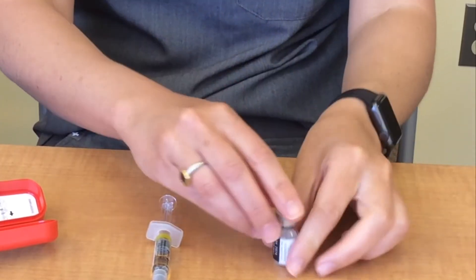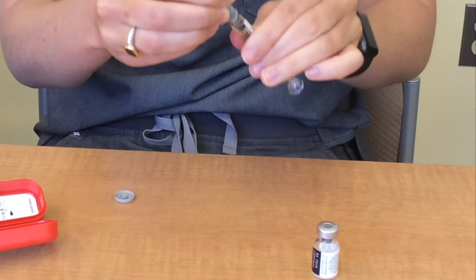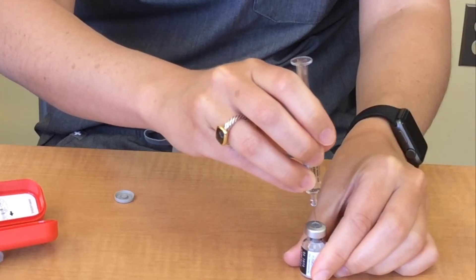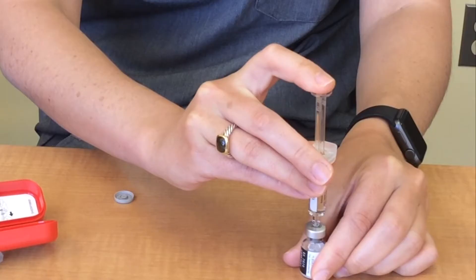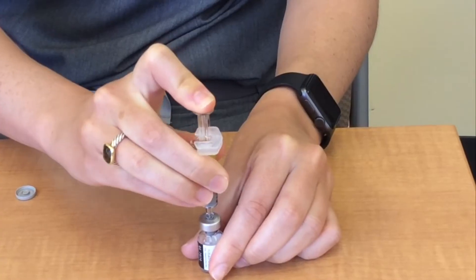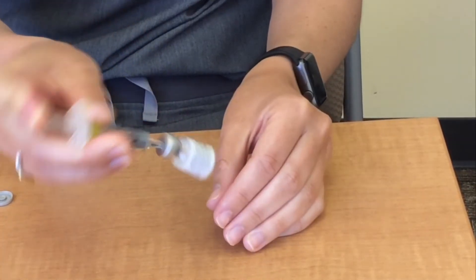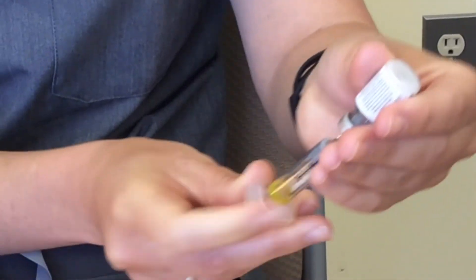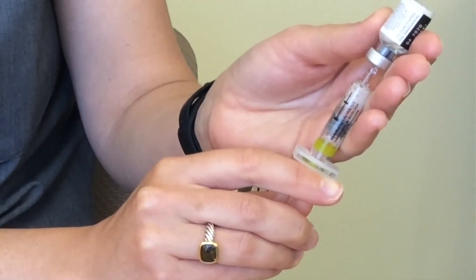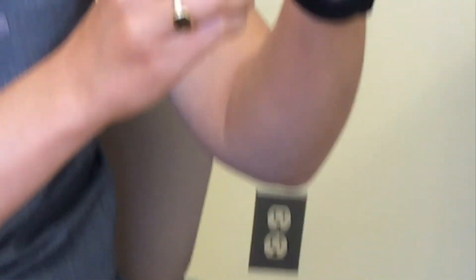First step is to remove the cap from the vial and place the vial on a flat surface. Next, remove the safety mechanisms from the syringe. Insert the syringe into the vial. Push the liquid from the syringe into the vial by use of the plunger. With the needle still inside the vial, swirl the solution around until the medication has dissolved and the solution is clear. Flip the syringe upside down so the vial is on top. Pull or withdraw all the solution out of the vial into the syringe. You may need to pull the needle to the top of the vial to remove all of the solution.